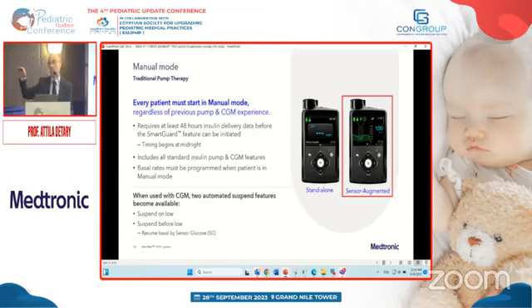Usually there are patterns, and we use a simple pattern. Some people make the pattern too sophisticated, some people make it simple. If you have an automated pump and the expectation is that you are going to mainly use the auto feature of the pump, the automated mode, then it doesn't make sense to create too sophisticated basal rates. You can even use a flat one, like this 0.8 per hour, or you can assume that during the night it is lower than the average. In the early morning hours, there is usually a rise for a couple of hours because of insulin resistance. And then in the rest of the day, it's around the average.